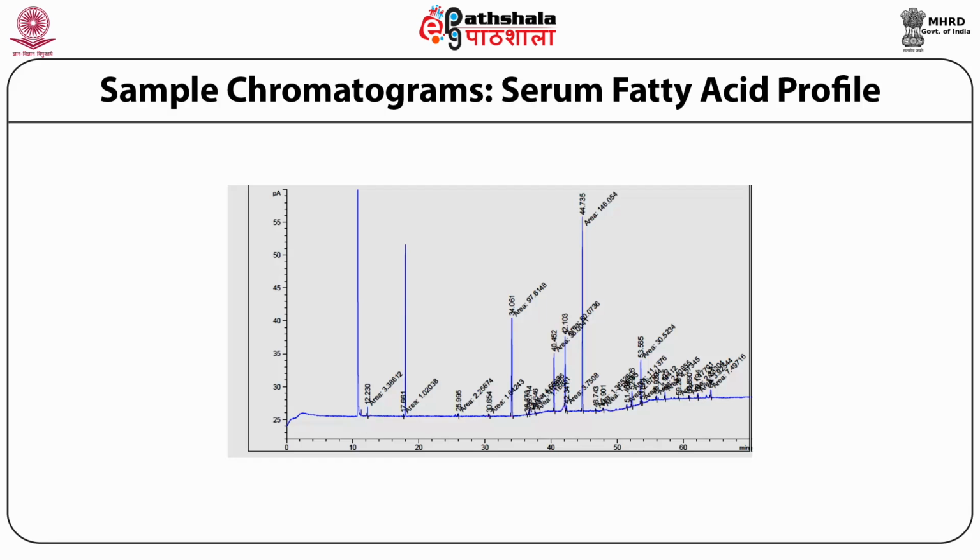rise in the baseline towards the end of the chromatographic run. So that is not ideal. However, this is the range that you typically observe when you're analyzing serum. This particular sample, actually the serum has been eluted out of a spot of blood from filter paper, and then that has been analyzed, so indicating to you the sensitivity with which this process can detect the different analytes.